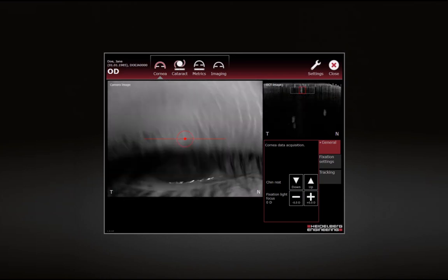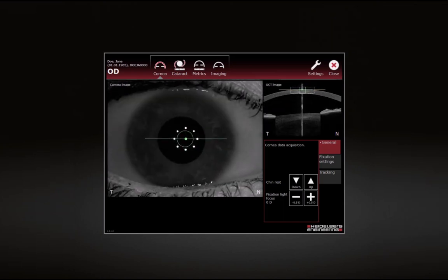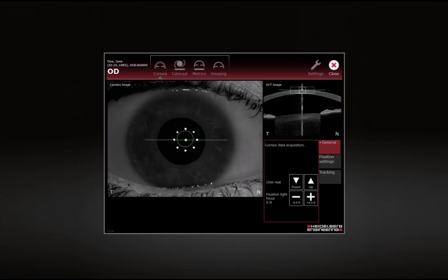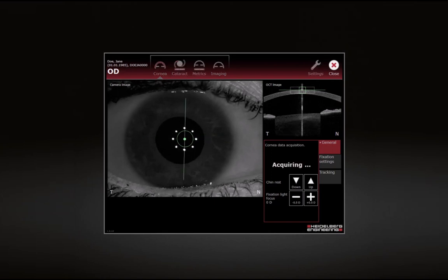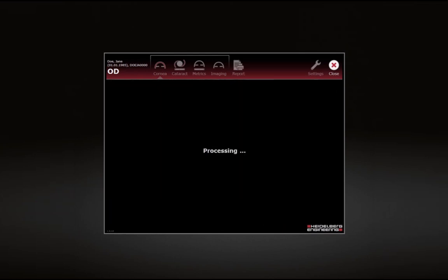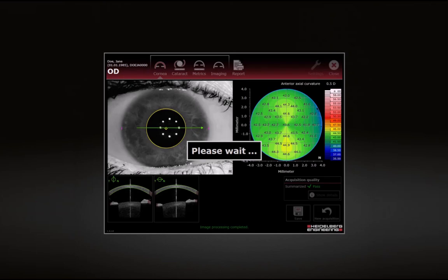Ask the patient to blink and then refrain from blinking for a few seconds. Realign the camera if needed and press the joystick button to start acquisition. Keep the device as still as possible. The examination stops automatically.